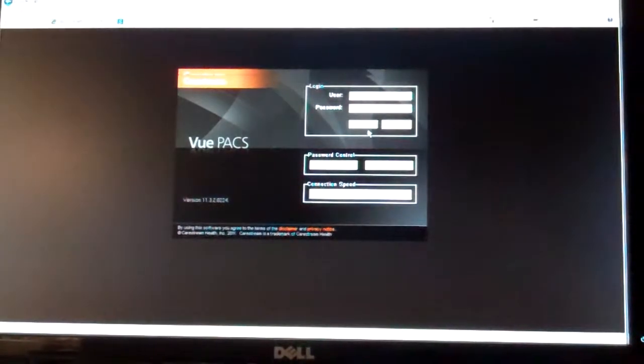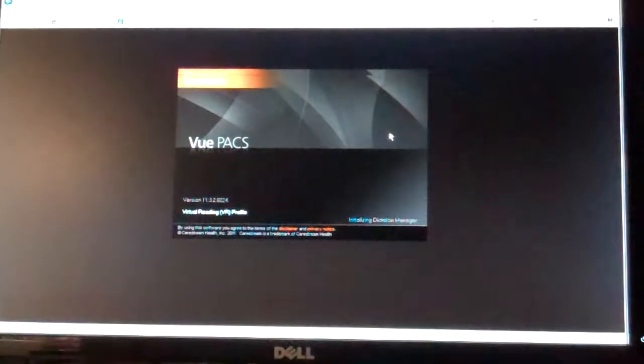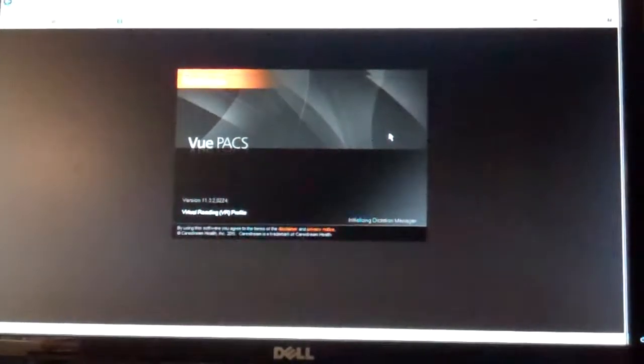Alright, this is a crash course into the new CareStream system. As you log in, it's going to look very similar to the way it did before.